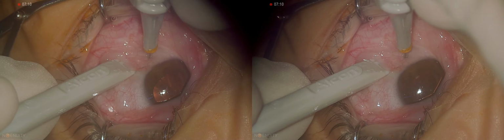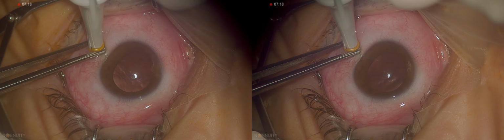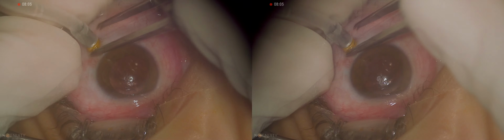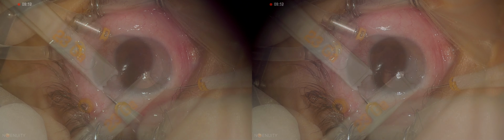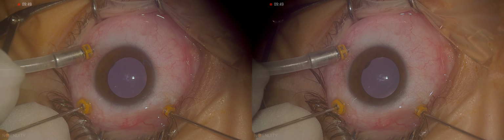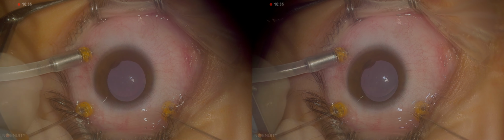Dilation was good and a 23-gauge vitrectomy was set up. Superotemporal, supranasal, and inferotemporal sclerotomies were placed. Infusion was not allowed in until its tip was seen and when the illuminating pipe could make it visible in a safe position inside the vitreous cavity.